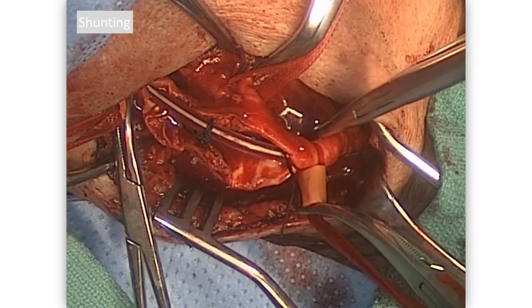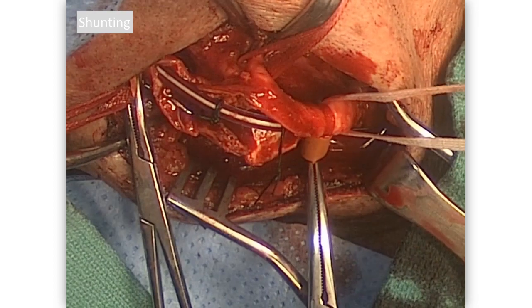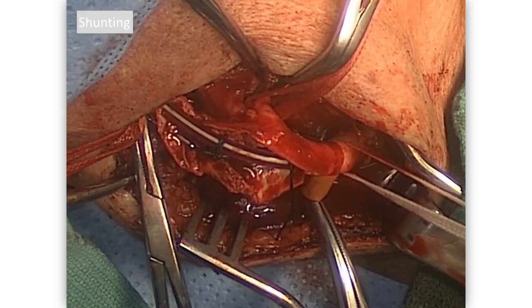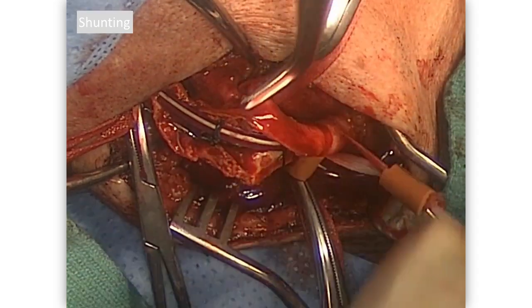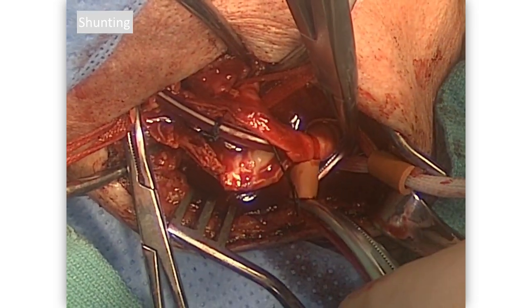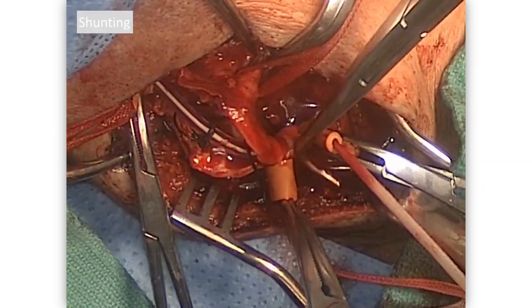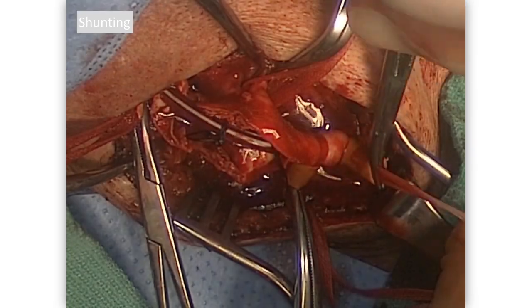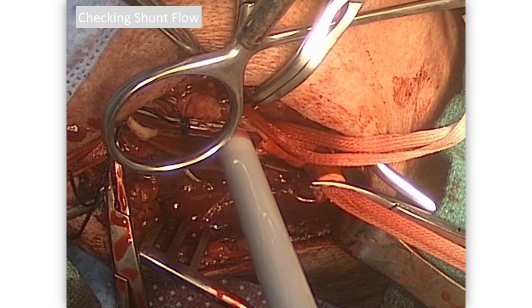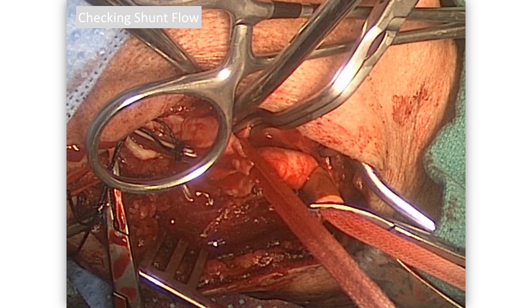We use transcranial Doppler to confirm shunt function. Both tapes are a little close to the end of the arteriotomy, so another tape is passed around — push down while the assistant collars it down. That buys another centimeter of exposure distally, and we do the same at the distal end. Take the first tape and collar off and hand it back to the scrub nurse, as these are all counted. Checking for flow in the shunt with a Doppler signal is one way to confirm the shunt is working, though with transcranial Doppler running we already know.